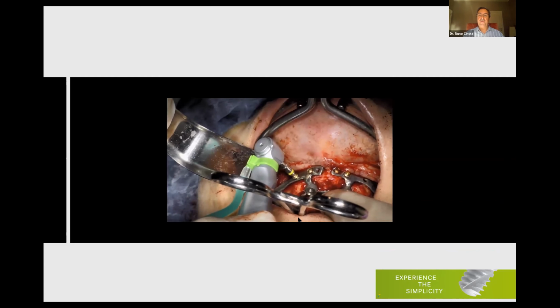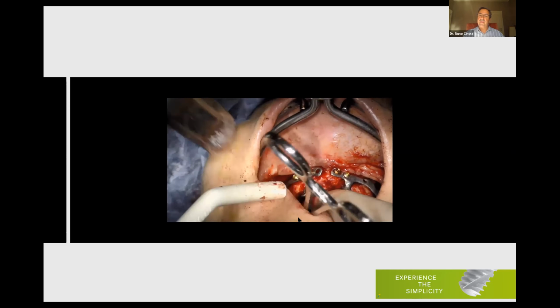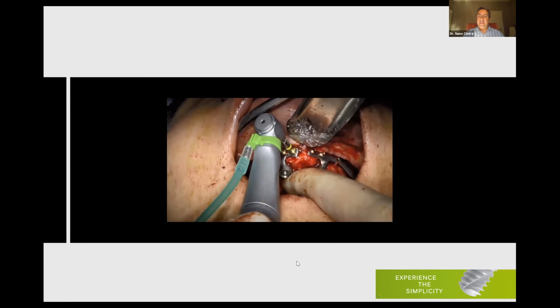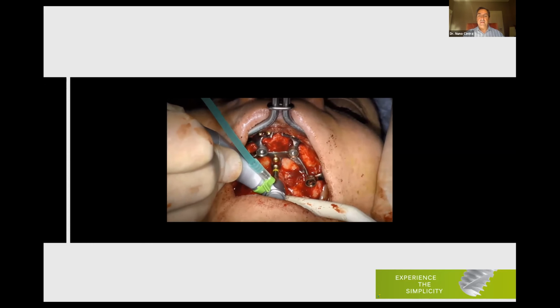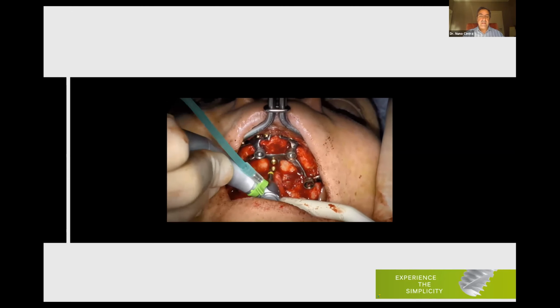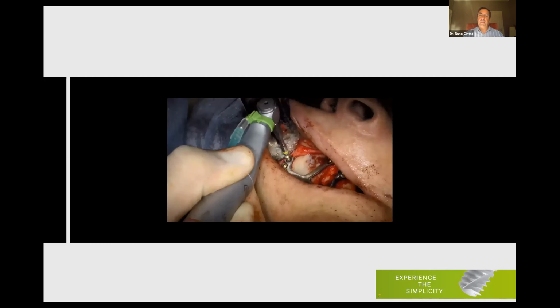The implant has to be in perfect contact with the bone. And as you can see now that I'm tightening the screw, there is a little bit of flexibility, which we'll see even better now, because this part of the implant, when we tighten the screw, is able to bend. And by bending, as you can see now, we can bend the implant a little bit, and this way we make sure that we'll be in perfect contact with the bone. Also here on the palate, the implant allows us to have some flexibility, and that flexibility will be very important to be sure that we are in perfect contact between the implant and the bone.